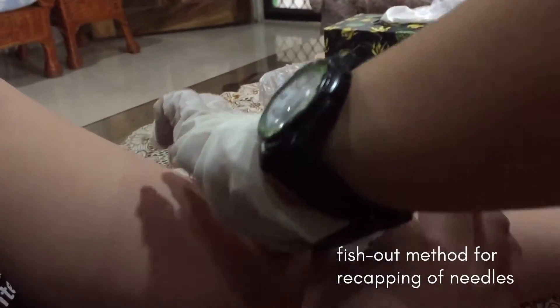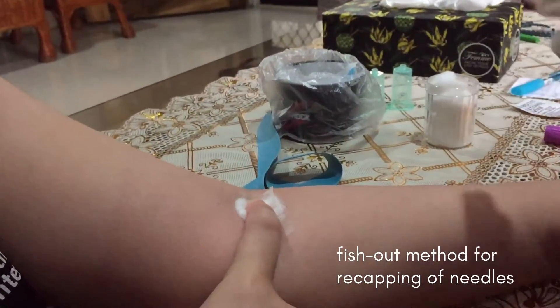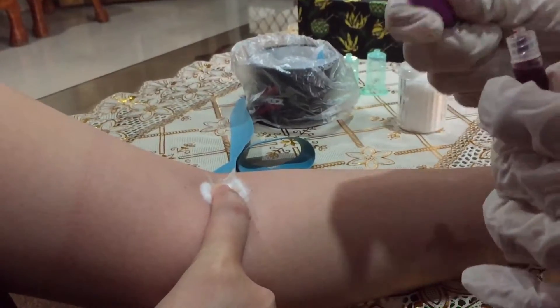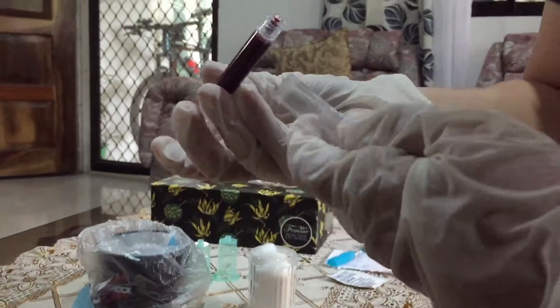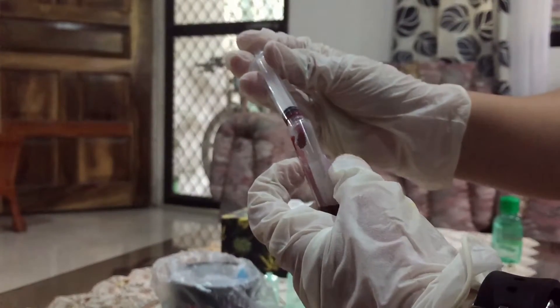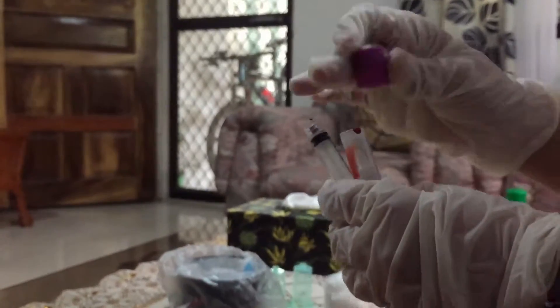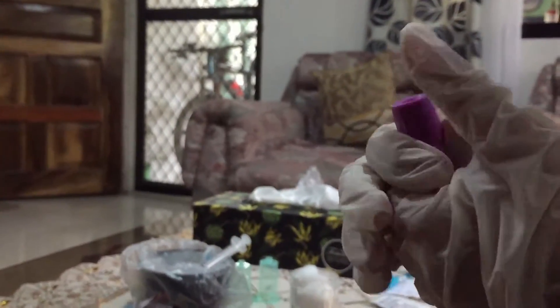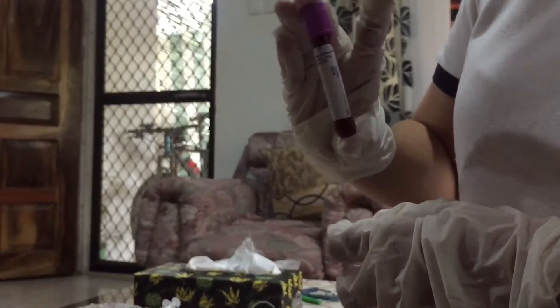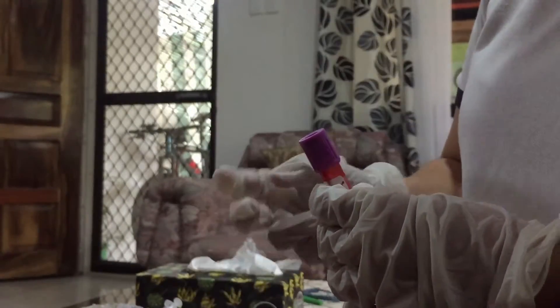Ma'am, kindly press the cotton for at least 2 minutes. Then transfer your blood sample. Don't forget to invert the tube 8 times. The inversion should be done slowly and gently to avoid hemolysis of the sample.